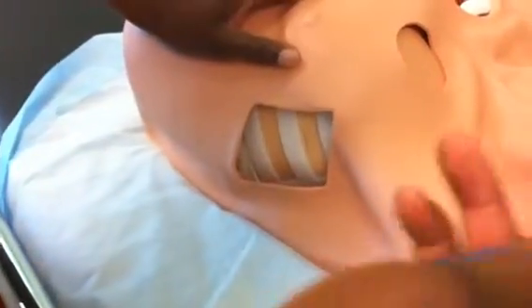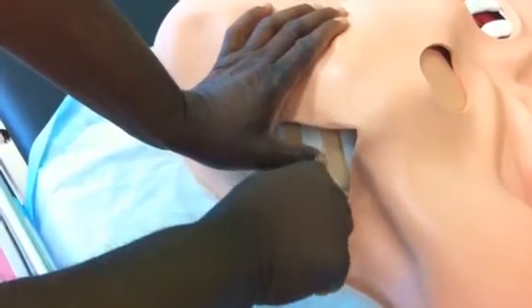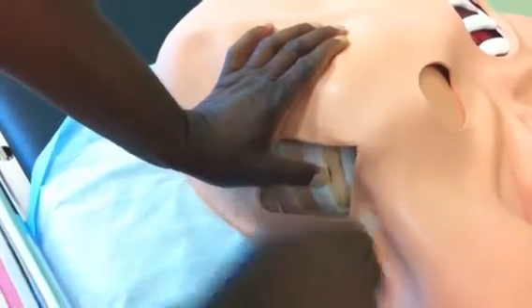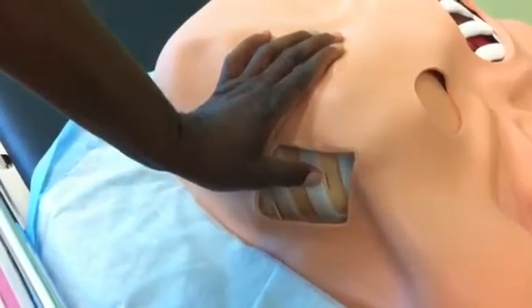Once we have the local anesthesia in, the next phase is to get my scalpel. At my reference point, I make an incision on the skin about five centimeters. I also probe a little bit with the needle and scalpel.